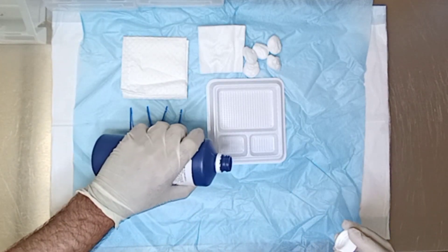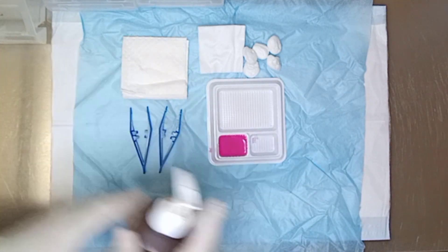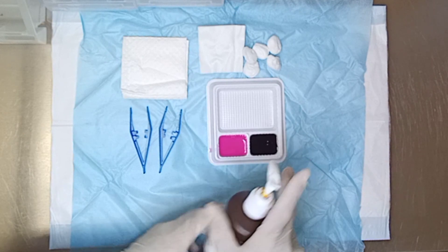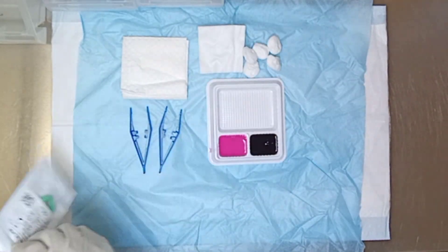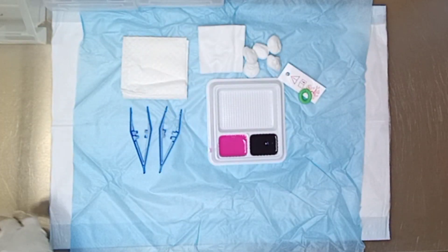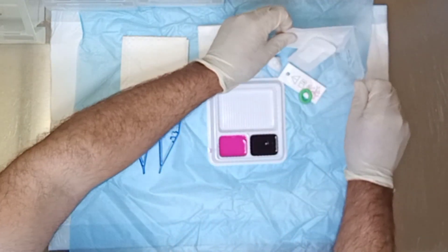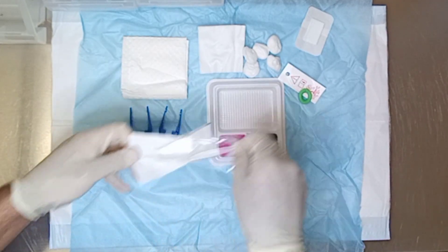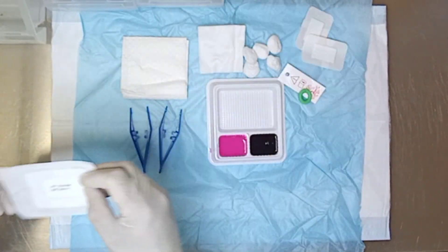First we pour our chlorhexidine solution — this is for the phenol flush. As you can see, I'm not touching anywhere of the basic dressing pack and the sterile area; I have non-sterile gloves but I'm not touching any sterile area. That is a tourniquet. You must keep the sterile field sterile. These are primopore dressings — they're sterile. I tend to wrap them with gauze around the toe; I find they hold the dressing really well. Normally I need about three or four of them.